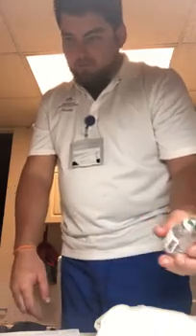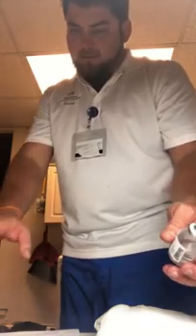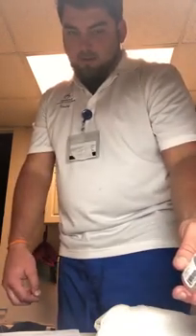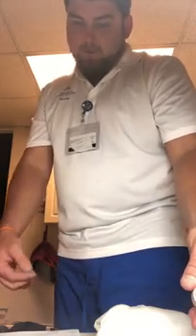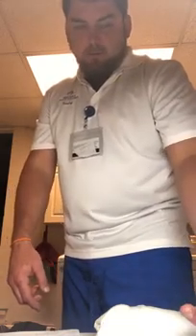So for the first one, we've got patient Anna Pawlowski, date of birth 5/5/1957. She is ordered to have 0.5 milliliters of the flu vaccine intramuscularly at 14:58, and we're going to document once this is given. Then we're going to retrieve the B12 injection.